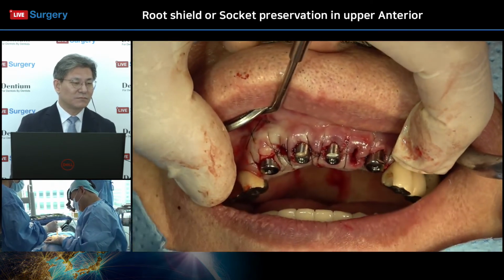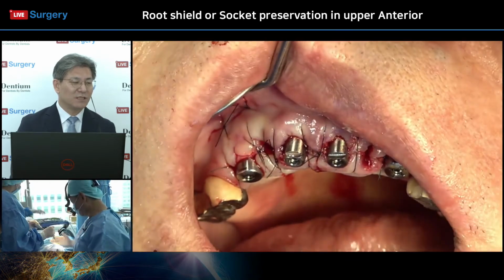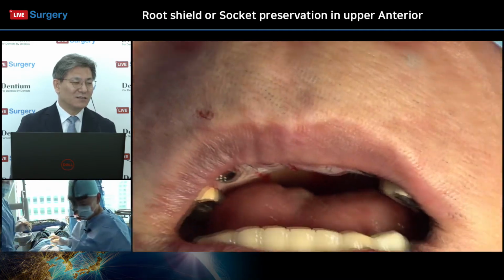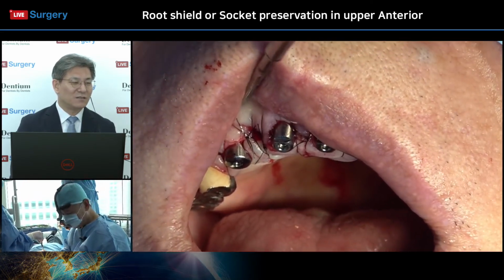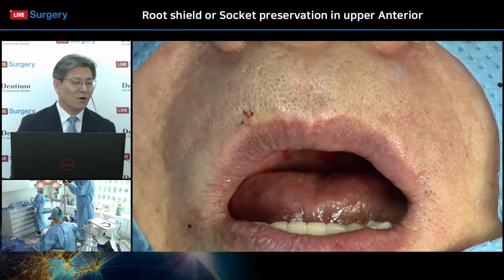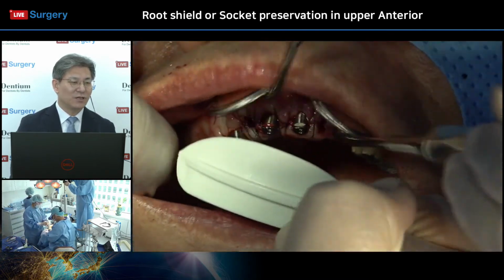One is the intraoral scanning or impressions, but at this time I will show you how to take impressions with the bite tray. Yeah. We will show you how to do the bite tray impression and also the intraoral scanning. Okay. So we can go both ways, intraoral scanner. At first with the bite tray impression. Yeah, bite tray impression. Okay.